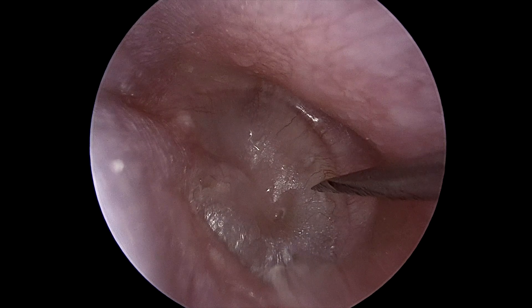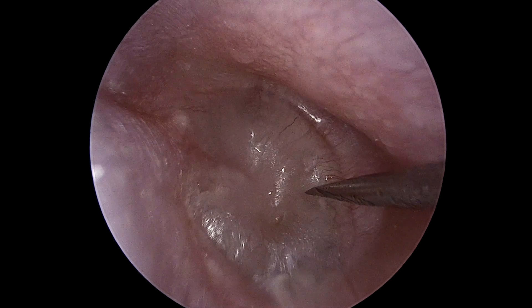A myringotomy knife is used to make a radial incision in the anteroinferior quadrant of the eardrum.